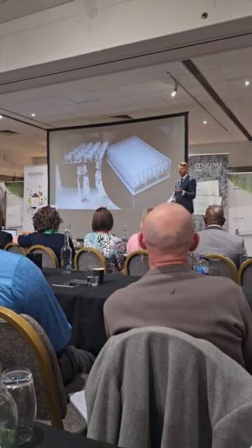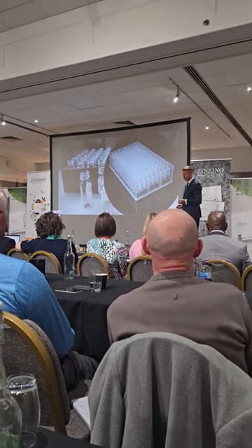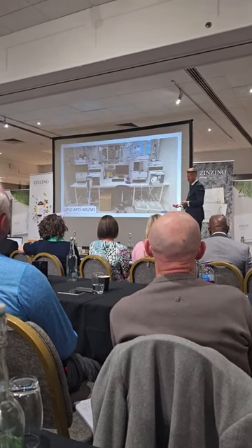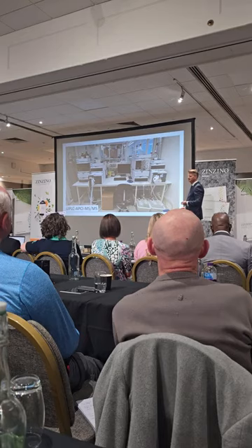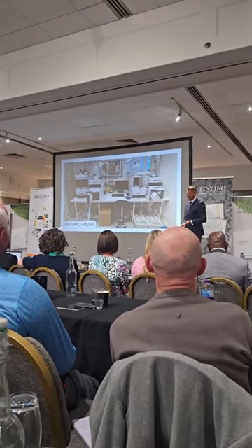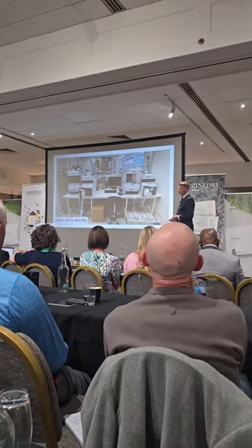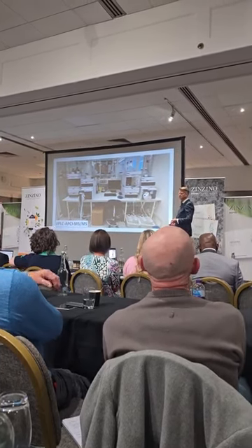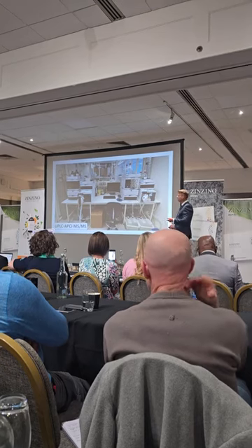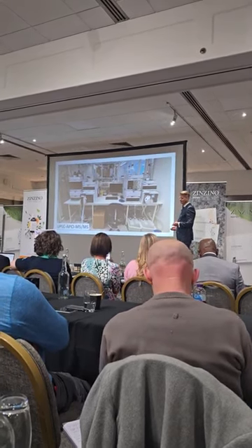We will add some liquid chemicals, we will heat, shake, and do the chemistry. And then we will do the final analysis with chromatography like this. So this is mass spectrometry, a very advanced type of analysis. These are two systems. Each system is about 400,000 pounds. And these systems can take 1,600 samples per day altogether.